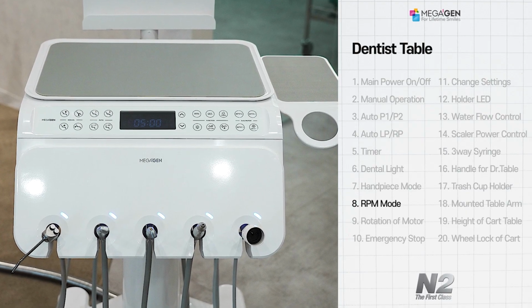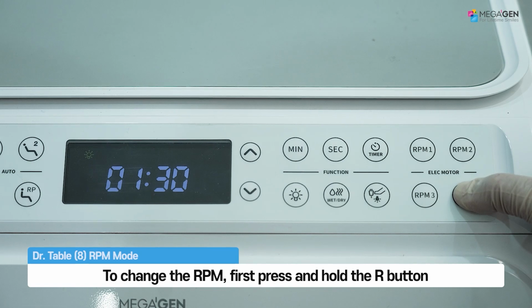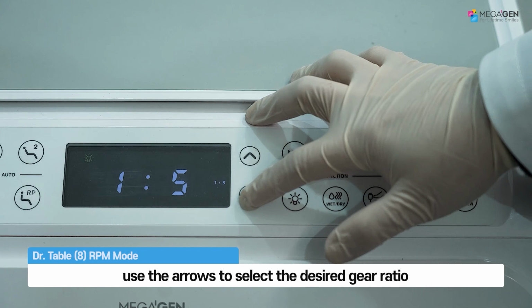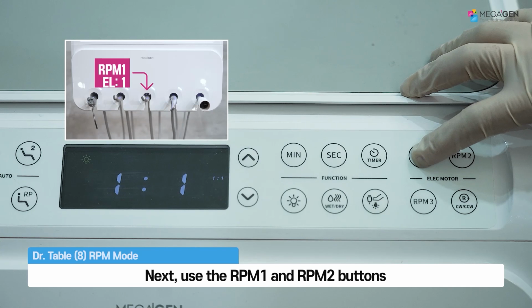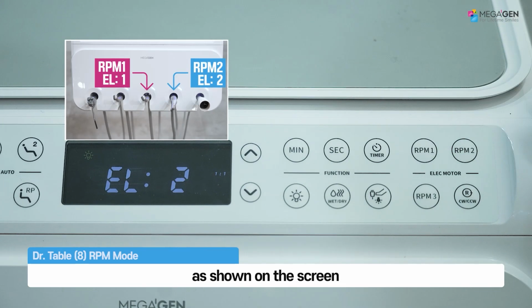RPM setting mode for electric motor use. To change the RPM, first press and hold the R button. When the current gear ratio is displayed on the screen, use the arrows to select the desired gear ratio from the 3 available options. Next, use the RPM 1 and RPM 2 buttons to select the motor position you want to use, as shown on the screen.